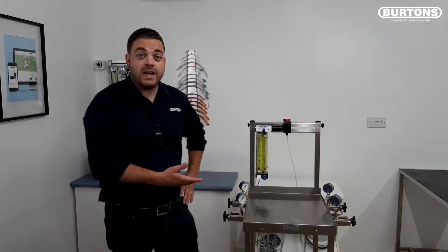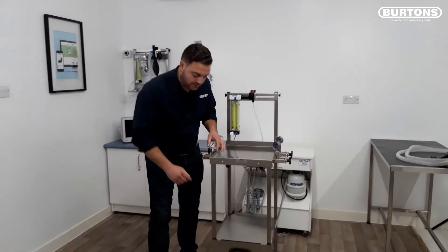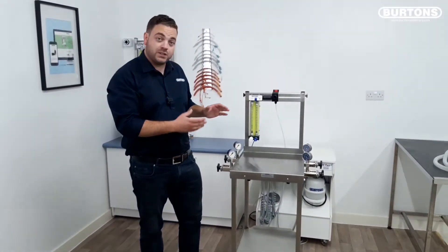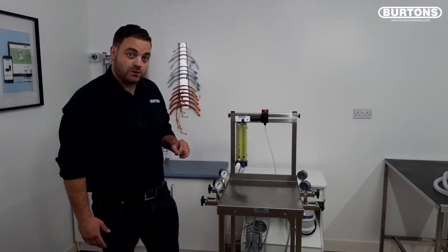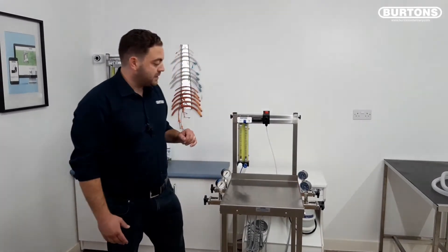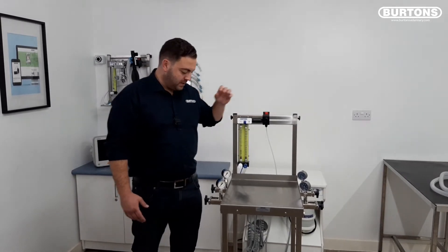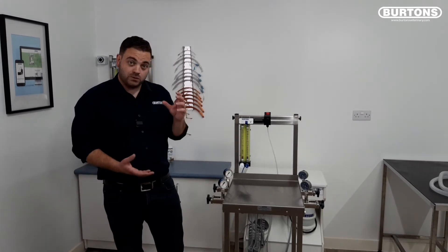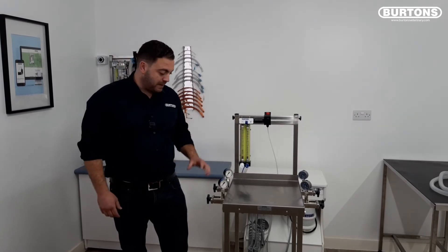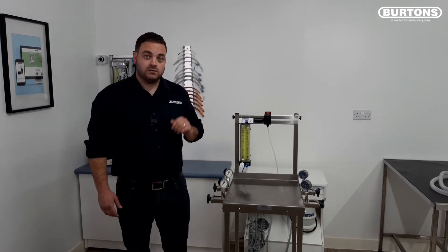Here we have the Burtons Veterinet anaesthetic trolley. As you can see it's a larger trolley with a larger shelf on top and it also comes as standard with a drawer for storage. This particular machine has been specified as a twin gas so it has O2 and N2O rotameters, two points for O2 bottles and two points for nitrous. It comes as standard with the vaporizer feed tube and the corner O2 flush unit. This trolley is particularly helpful for people that want to use the smaller E size cylinders with the round bottom, which are easier to handle — especially if you have a clinic that doesn't run pipe gas and has a theatre on a first floor.